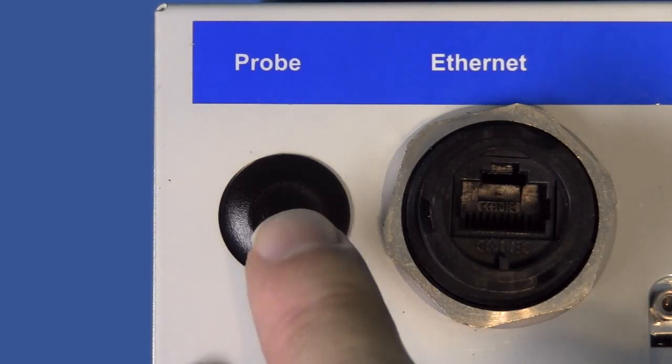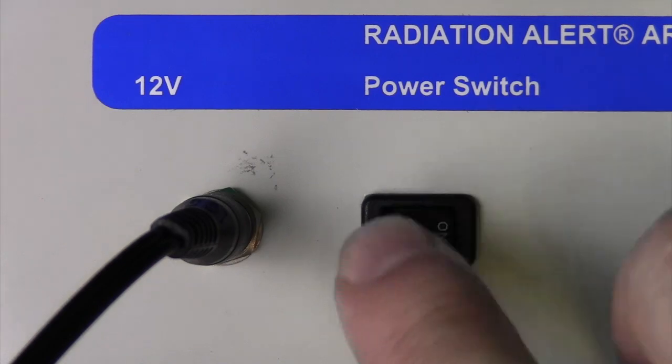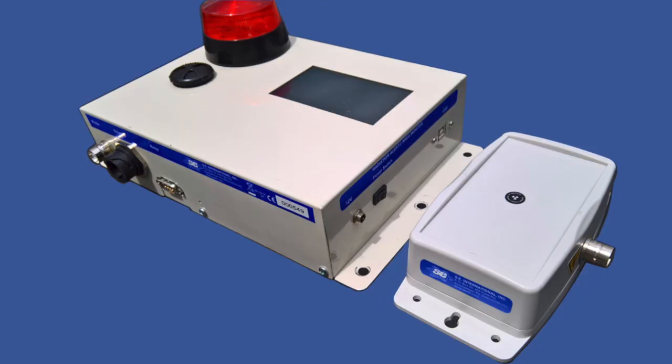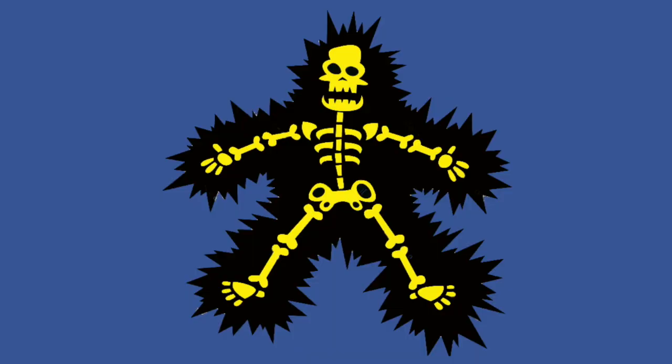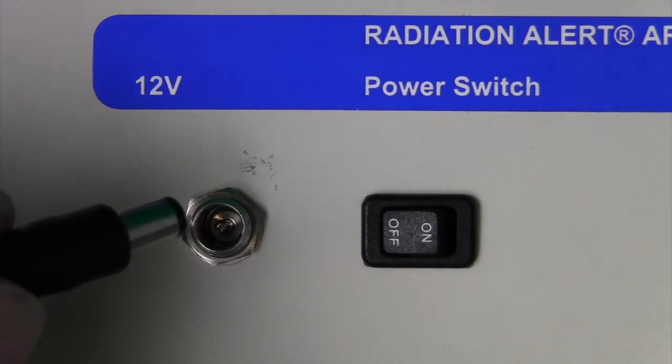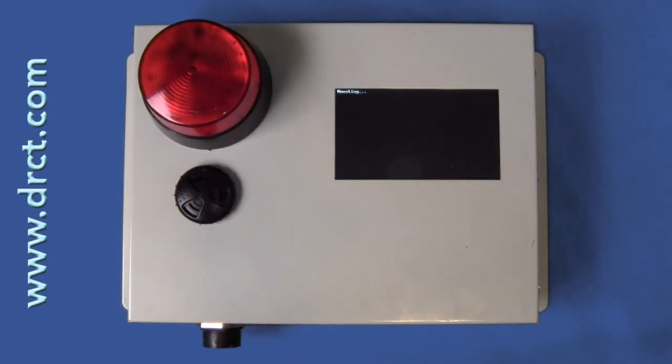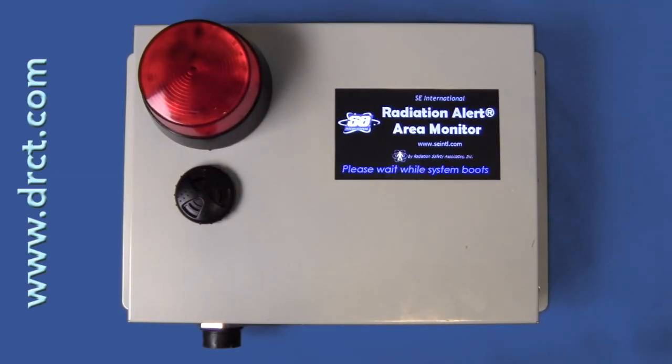If you are using an external detector, ensure that the unit is powered off and unplugged before connecting the detector to the area monitor. You want to avoid a dangerous electric shock. To start, make sure the cables are connected and power up. We first see the startup screen. The fast boot up takes only about 30 seconds.